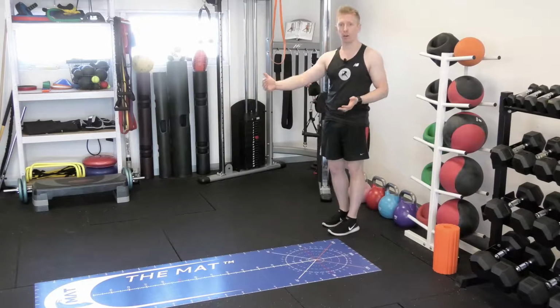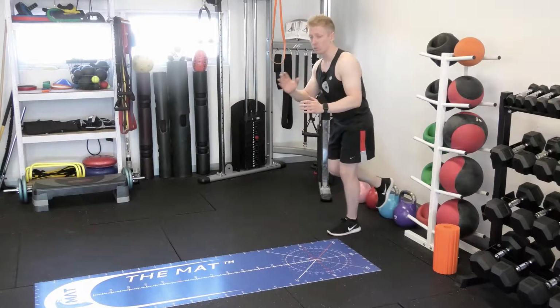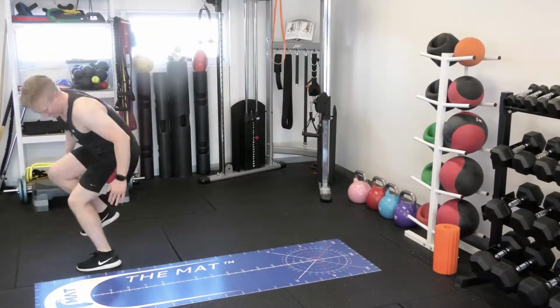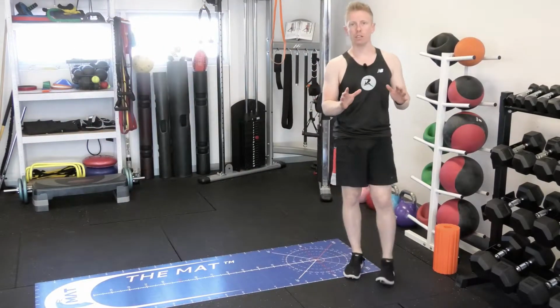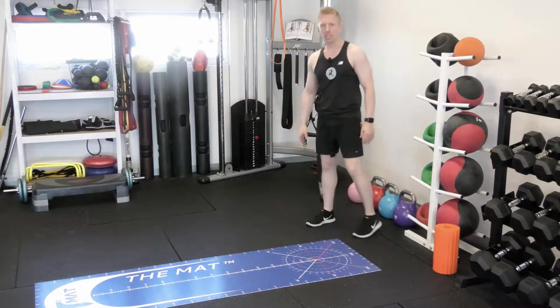So I've already done my 3 practice hops. I'm now going to do 3 test hops on my left leg. Don't laugh too much. So now I've completed those hops on the left leg, I've got an average of about 145 centimetres. Now let's have a look at the right.